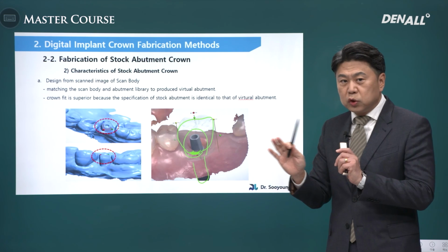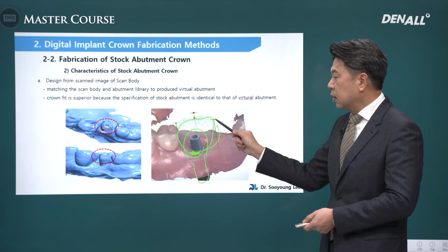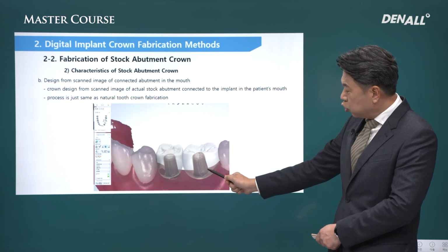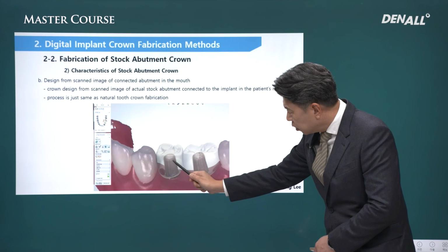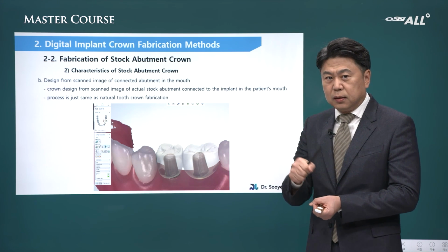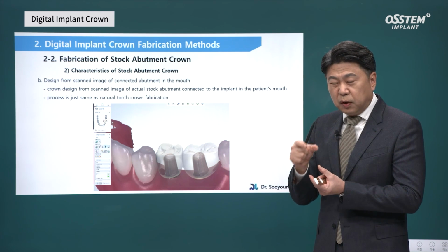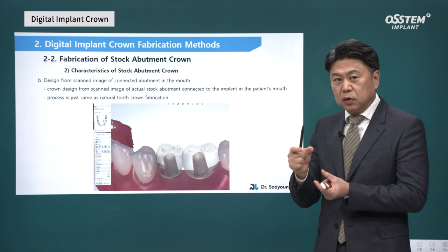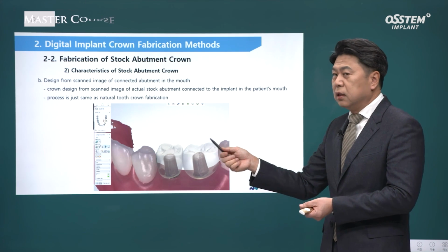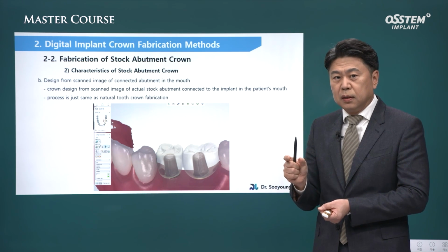Of course, there are differences between custom abutments and stock abutments, but the digital process here is the same between the two. The impression was taken directly in the mouth. It looks irregular because when we scanned it, the transfer abutment, the titanium metal abutment connected in the mouth, is reflecting light, so it is not easy to take an impression using an intraoral scanner.